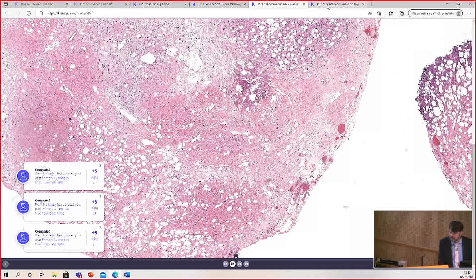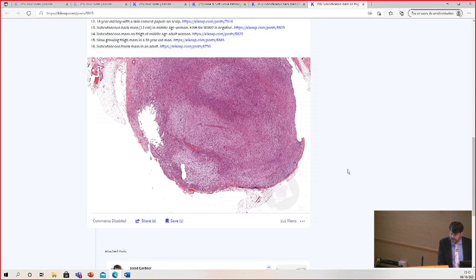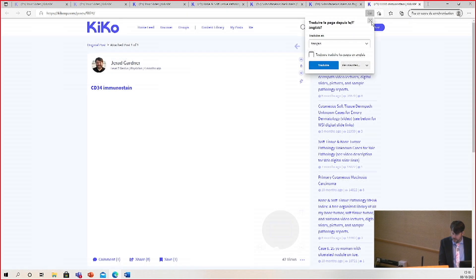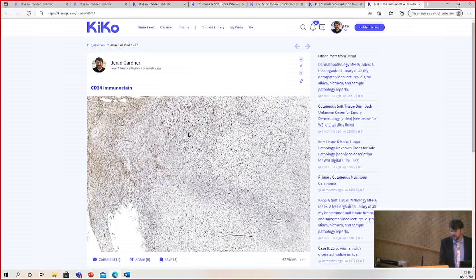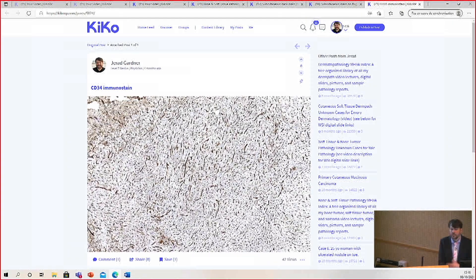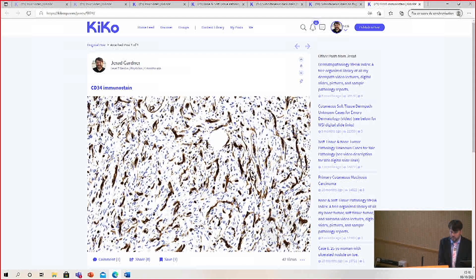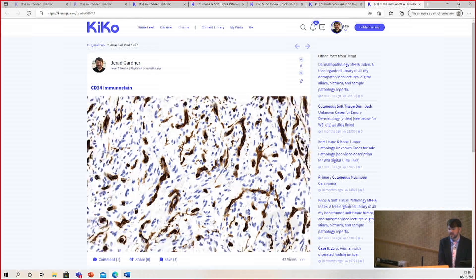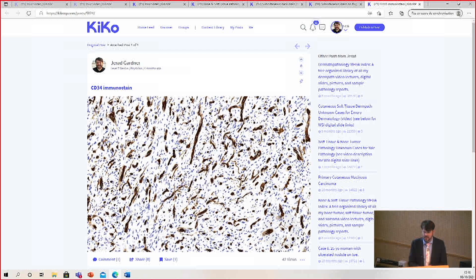Here is the CD34 immunostain, and the main reason is to highlight the background vascular network. In this case, CD34 is mostly negative with only some very focal staining — an argument against solitary fibrous tumor. You can see most of the spindle cells are negative, whereas the endothelial cells of those vessels stain nicely. And look at how incredibly vascular this lesion is.